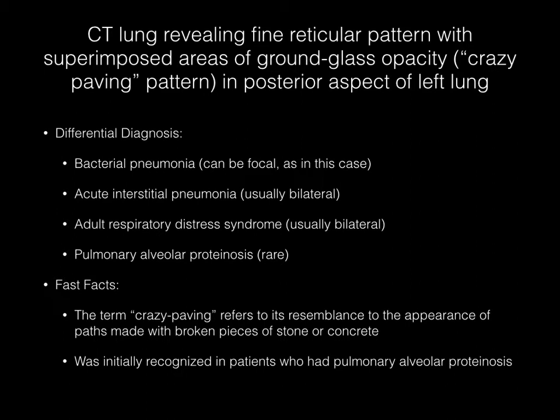This CT image demonstrates a fine reticular pattern with superimposed areas of ground glass opacification, the so-called crazy paving pattern in the posterior aspect of the left lung. The differential diagnosis here should include bacterial pneumonia, which can be focal as in this case; acute interstitial pneumonia, which is usually bilateral; adult respiratory distress syndrome, which is usually bilateral; and pulmonary alveolar proteinosis, which is fairly rare.